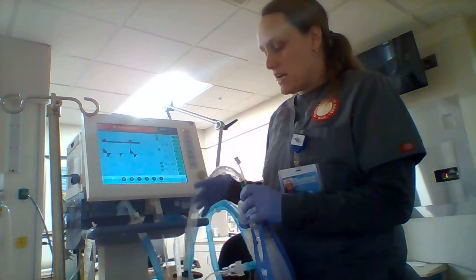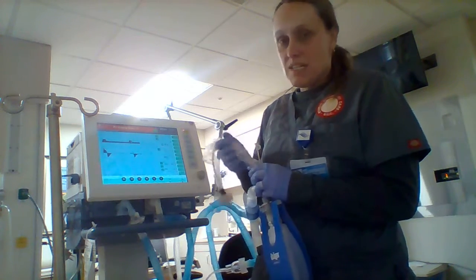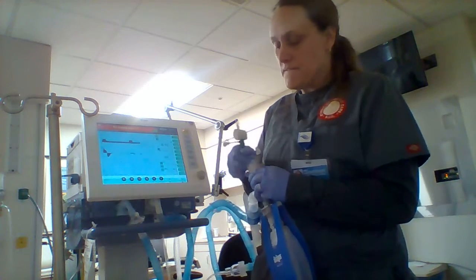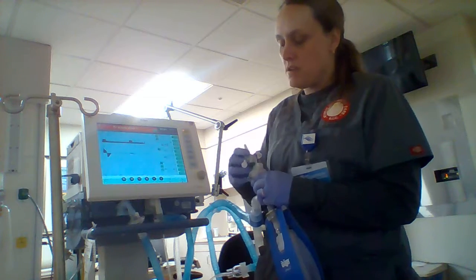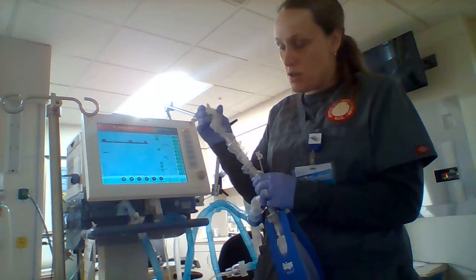So I have my test lung, which represents my patient. Let's say I need to suction them. So I'll jam that down in there until they cough. Pull it back while squeezing the thing so it's actually suctioning. Do not suction on the way down.